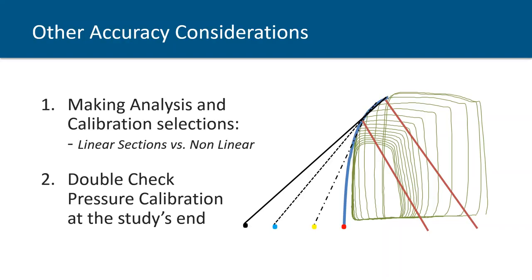And just to quickly highlight an example here, I'm sure many of you working with rats and mice, every time you do a preload reduction and construct the ESPVR, you can see it's very curvilinear. And as you're applying fits to this, if you're trying to apply a linear regression to a nonlinear ESPVR, depending on which loops you've actually picked, you can get very, very different slope values.